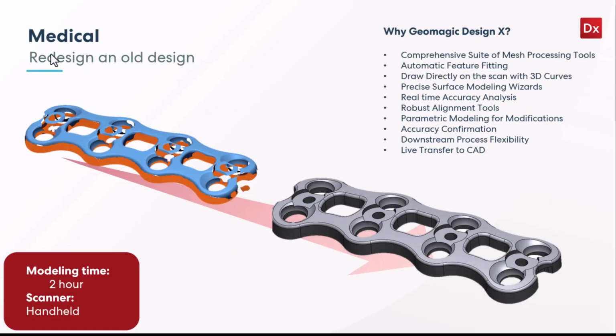So if we jump over, it was a medical object here, and you see it's this type of brace. It's a really neat application, and it was actually quite quick to reverse engineer, and it was only 2 hours to do. So if I go ahead and jump over to the Design X, we'll get started here.